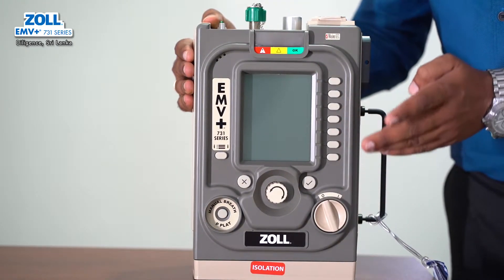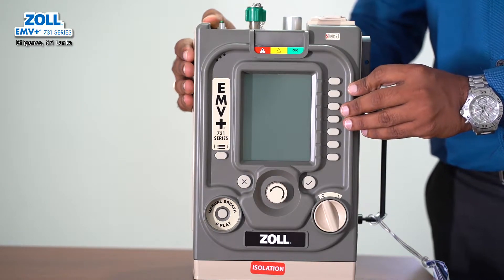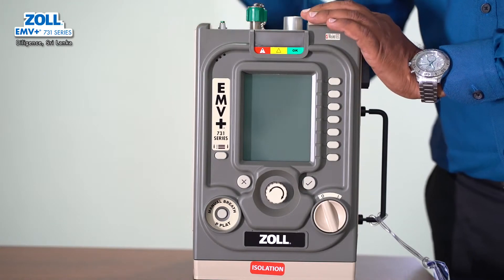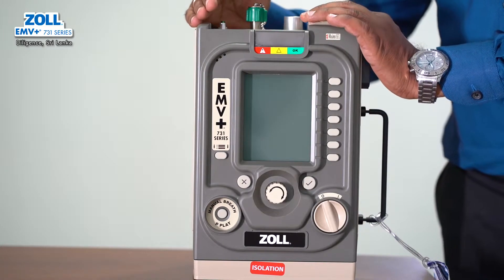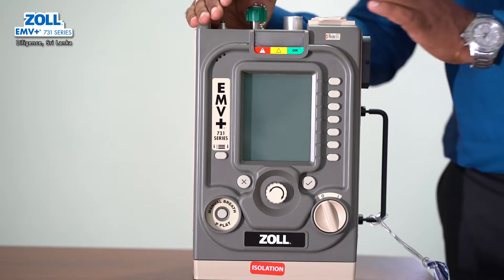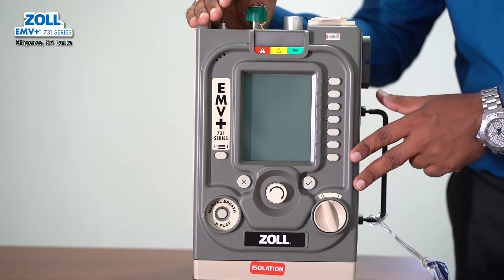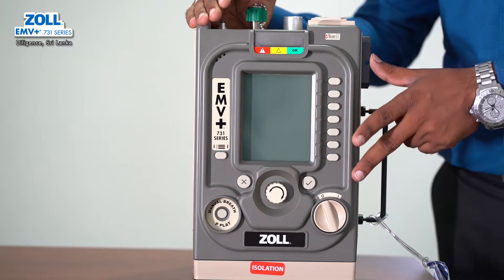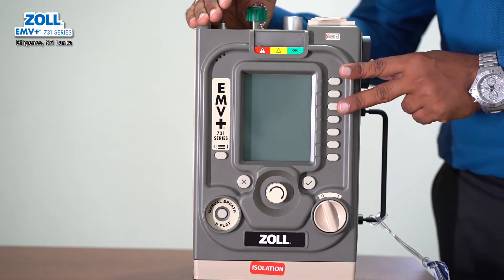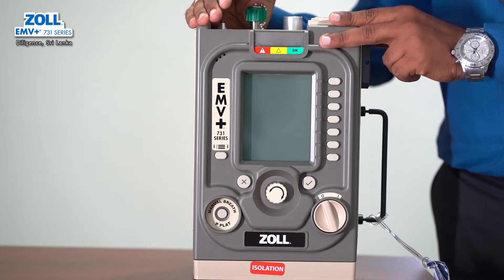The ventilation modes available are SIMV, Assist Control, CPAP, and BiPAP. The patient uses a breathing circuit — the adult pediatric breathing circuit and the infant pediatric breathing circuit.